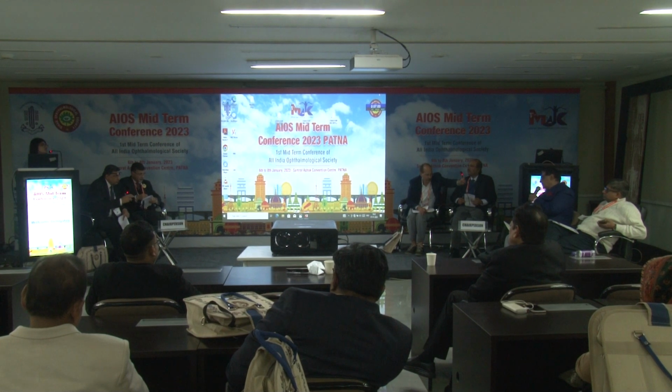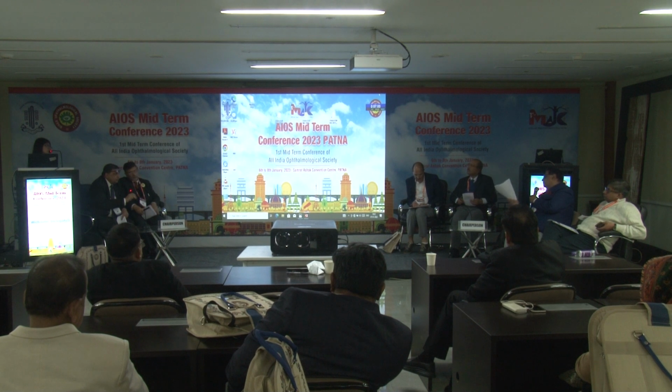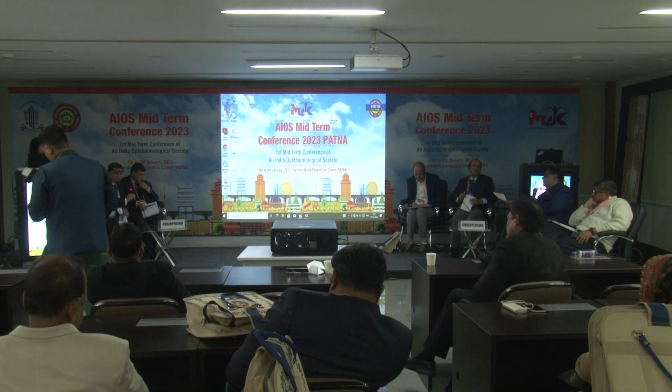Thank you. Okay, and does the AST have the sensitivity to, say, moxifloxacin? Because the other ones don't have it. Yes, sir. They give the sensitivity pattern against moxifloxacin, but they cannot say whether it is the topical or the ointment form, but they give the sensitivity pattern against moxifloxacin, sir. Okay, so basically this is going to give you the results against ophthalmology-specific antibiotics also.